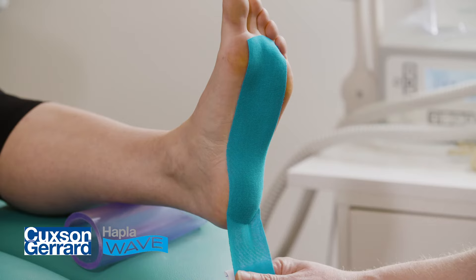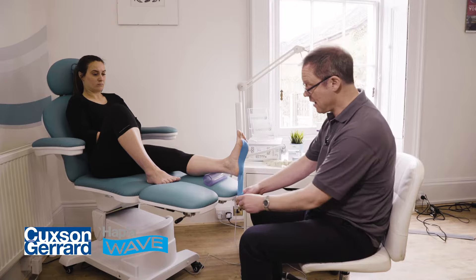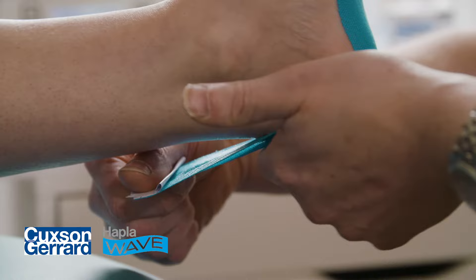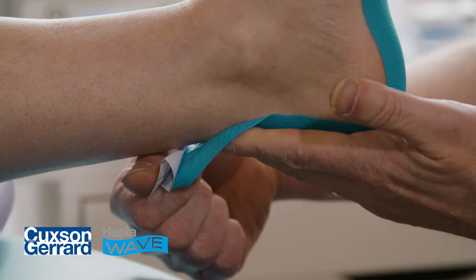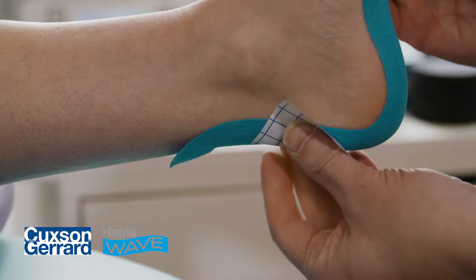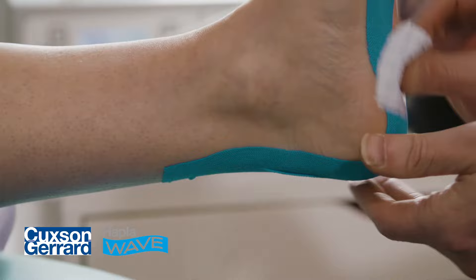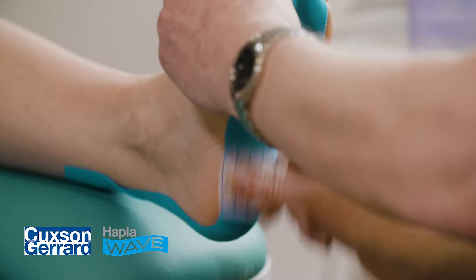Now we're going to pull away the rest of the paper here to establish the second anchor point. This second part will also come at 50% stretch around the posterior aspect of the heel, where we put it on the stretch and then smooth it onto the skin, keeping good contact. The Achilles tendon runs central to the tape. Just lifting the foot slightly, we have our final piece of tape, which is the anchor point. We smooth that onto the skin to establish that final anchor point. You can, if you wish, use the waxy part of the paper to rub the tape to establish some friction and activate the adhesion through the application of a bit of heat.